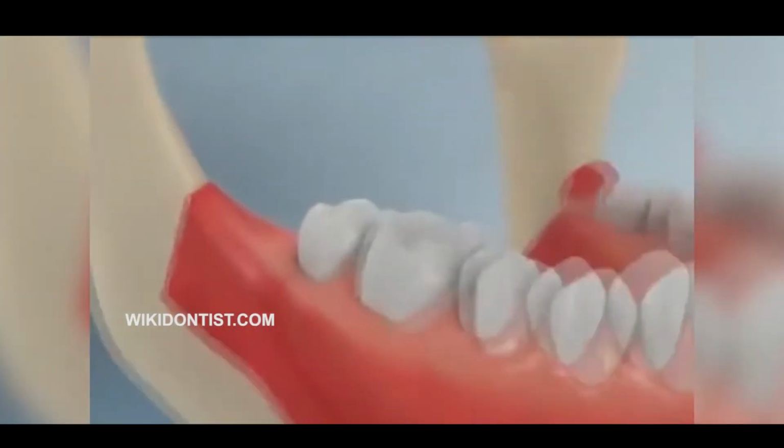This is an animation video, and you can see how it is done. There are two procedures: you can take the bone off and take the tooth out as a whole, or there is another way, which is to cut the tooth into different pieces and then take it out. Today we are going to talk about the latter option, cutting the tooth into different pieces.